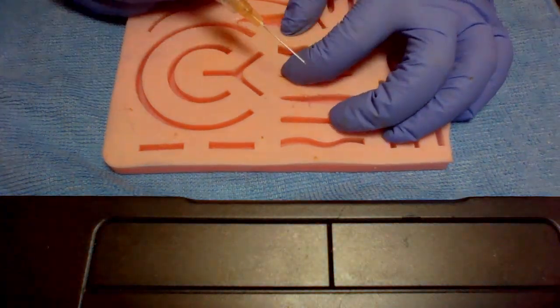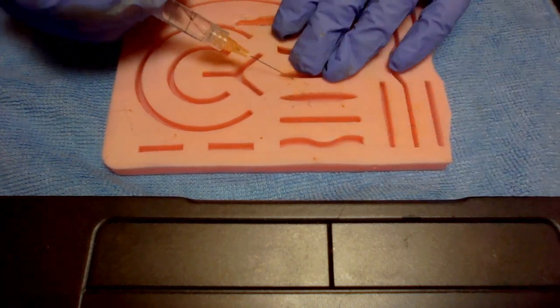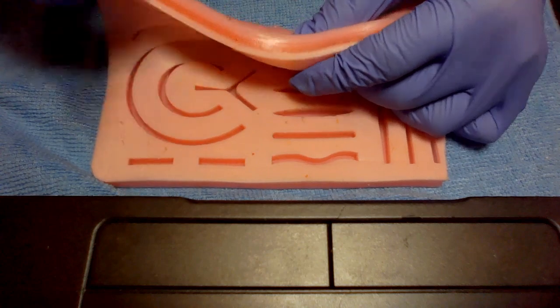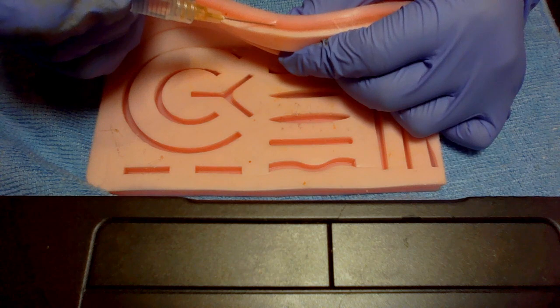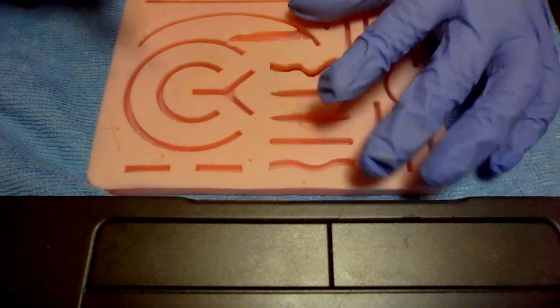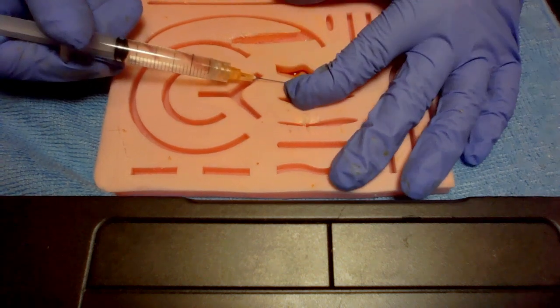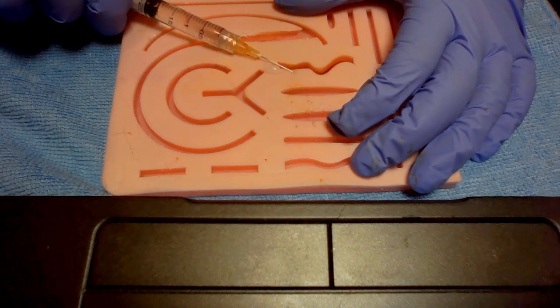So now we're going to go in the one we're trying to go in. I guess we'll go in this one because it's easier for y'all to see. You see, I'm going to go right in. We have three layers here: the epidermis, the dermis, and then the subcutaneous fat. First off, I'm going to teach you how to do an epidermal injection. We're going to lightly put the syringe in, just in the epidermis, and push a little in, not too much.